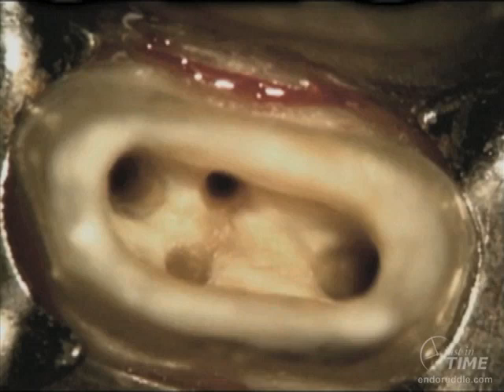As an example, when general dentists finish cutting a crown preparation and they hang up their handpiece, typically what they do is they look in the mouth mirror. And they're looking in the mouth mirror to observe, do they have draw? You can use this same analogy when you look into your finished access. If you can look into your mouth mirror and without moving the mirror, if you can see all the orifices in a multi-rooted tooth, you have great straight line access. On the contrary, if you have to move your mirror to see each individual orifice, you're underprepared and the window at the top of the tooth is too small.